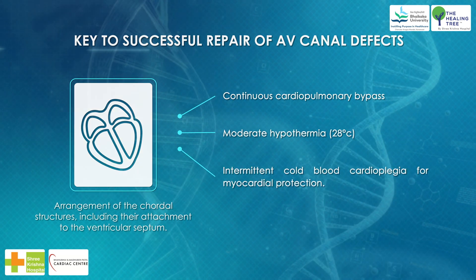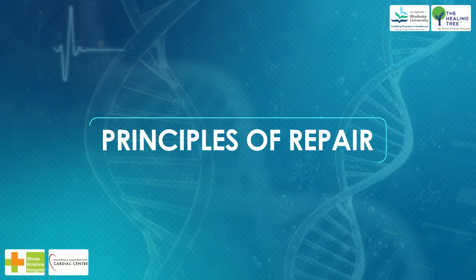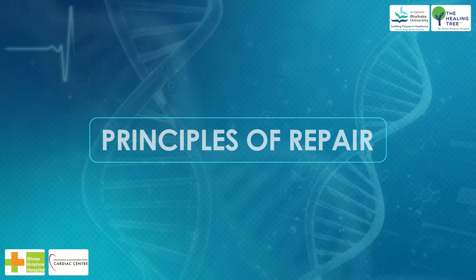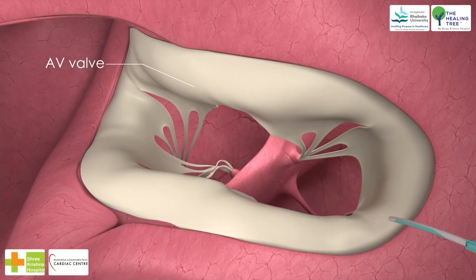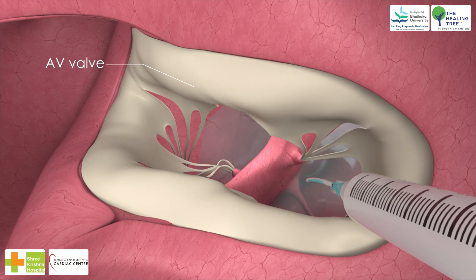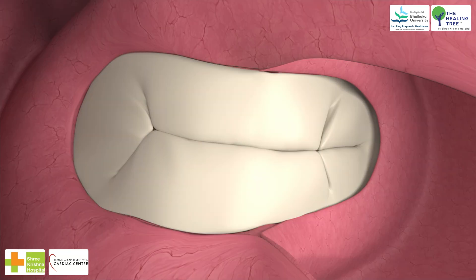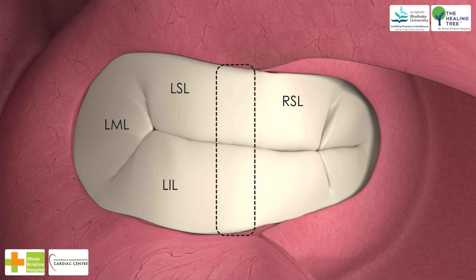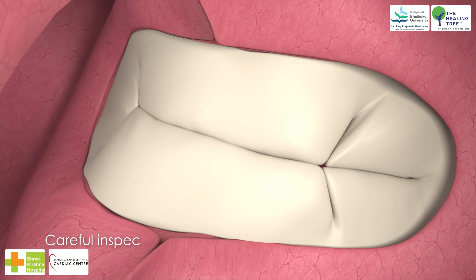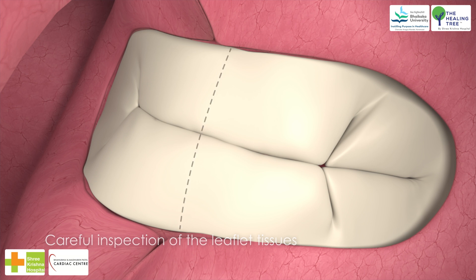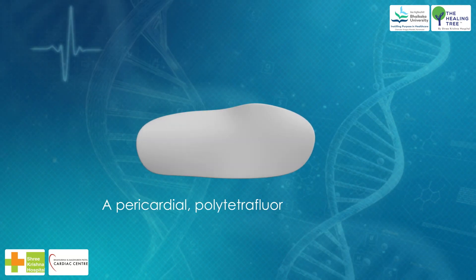The procedure is performed using continuous cardiopulmonary bypass, moderate hypothermia at 28 degrees Celsius, and intermittent cold blood cardioplegia for myocardial protection. Principles of repair: (1) the ventricular chambers should be gently filled with cold saline to float the AV valve leaflets to their closed position; (2) floating the valve leaflets with saline helps identify the line of apposition between the anterior and posterior common leaflets; (3) careful inspection of the leaflet tissues identifies the line dividing the valves into right and left components.